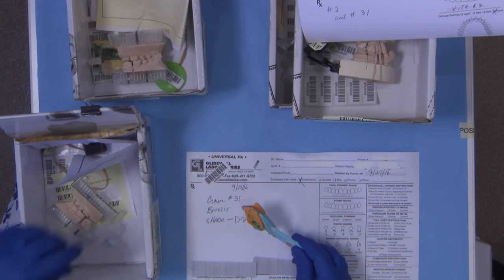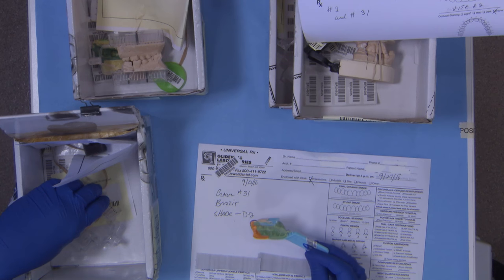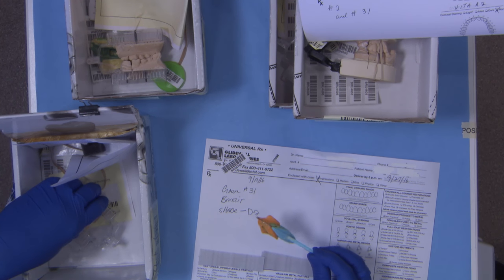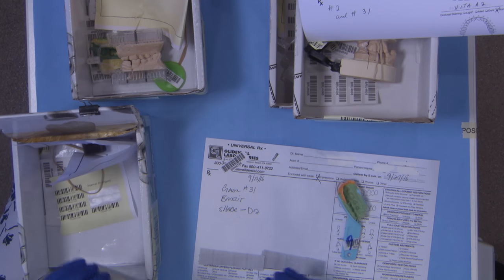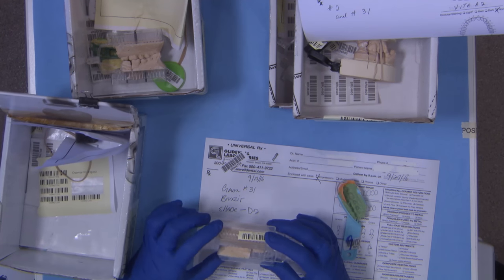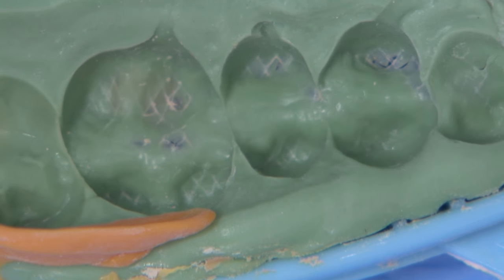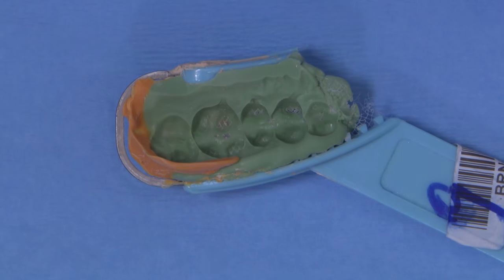We can see this impression was taken with a plastic quad tray. The lab poured the models and mounted them on a plastic articulator. When we look at the articulated models, there is absolutely no occlusal clearance. This happens because the patients tend to overclose when biting on a quad tray.